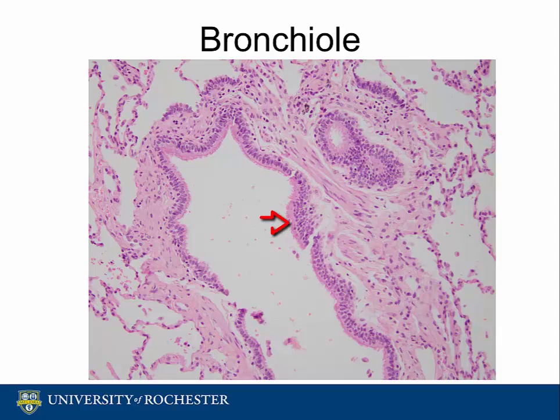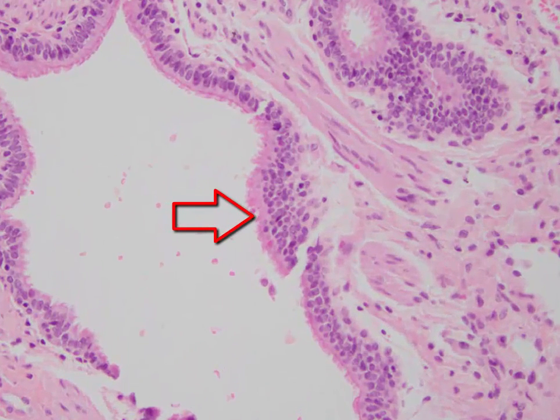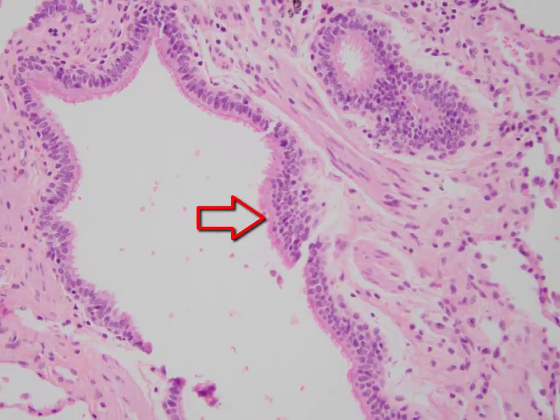Here we can distinctly see the ciliary brush border that is characteristic of many of the body's epithelial linings. The rhythmic beating motion of the cilia moves mucus from the lungs upward toward the epiglottis, where it is swallowed.